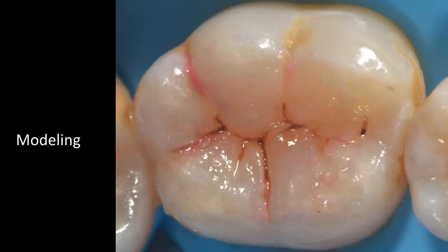So here is the sculpting of the restoration, cusp to cusp build up. You can see the pits and the fissures, and every cusp has been defined beautifully and separately.